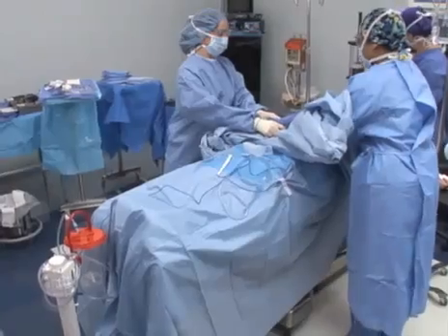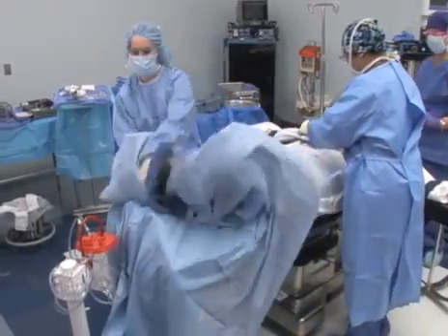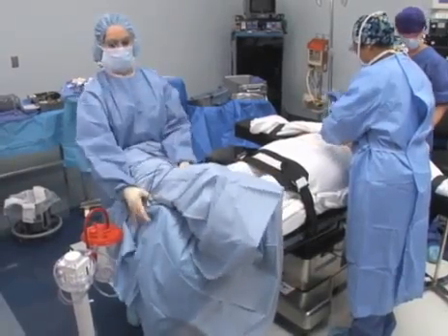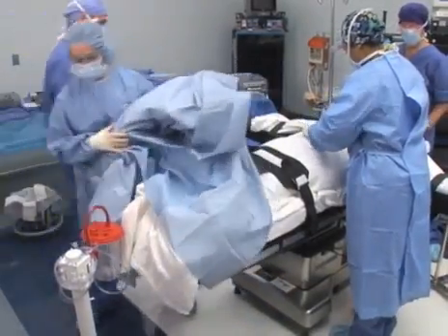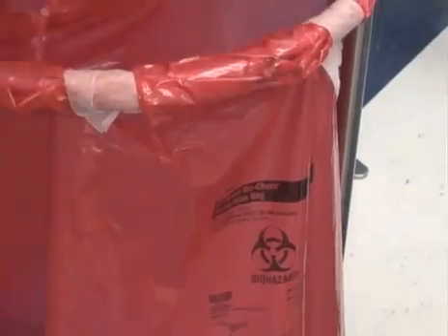When removing the drapes, pull them away from the patient, starting at the patient's head. Begin rolling them and proceed downward toward the feet. Be careful not to dislodge any wound drains. Drapes should be contained with as little movement as possible, with the ends wrapped toward the inside to confine blood and body fluids to the inner surface. The drapes must be placed in a designated biohazard bag.